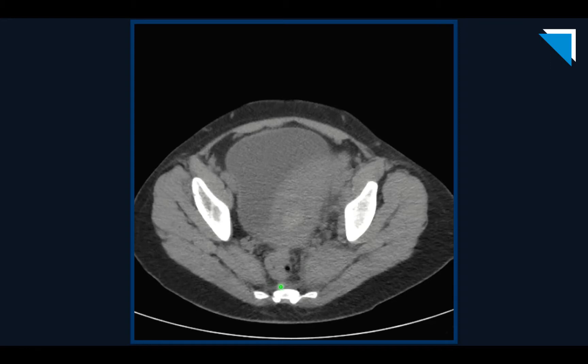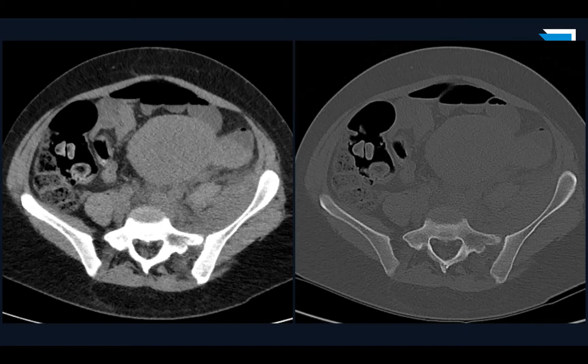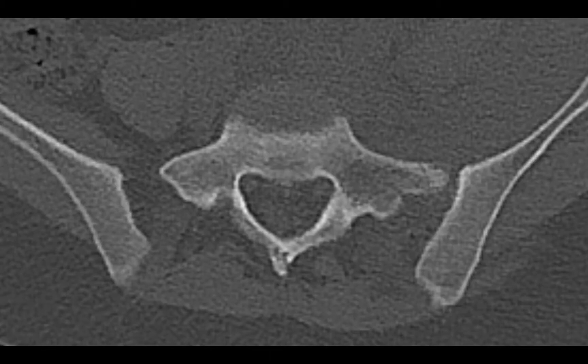It turns out that all of those findings are secondary findings to the true problem, which can only be seen on the bone windows. Here are axial soft tissue windows and axial bone windows. Let's zoom in on the sacrum. Comparing left to right at S1, the right S1 sacral ala appears intact. There is an extremely subtle lucency of the left S1 sacral ala.